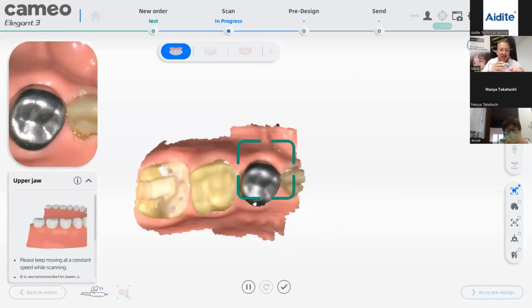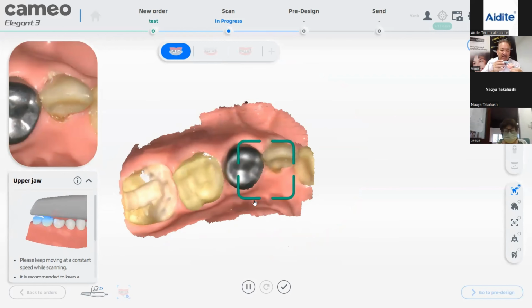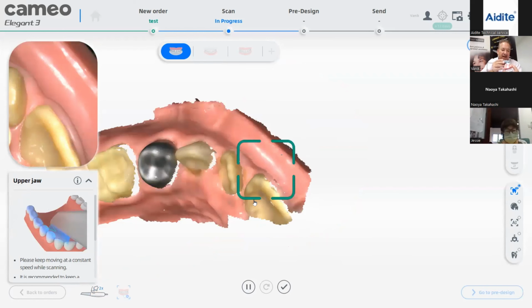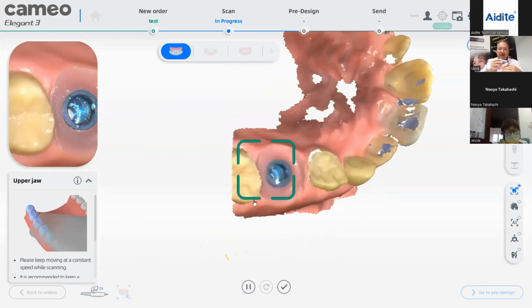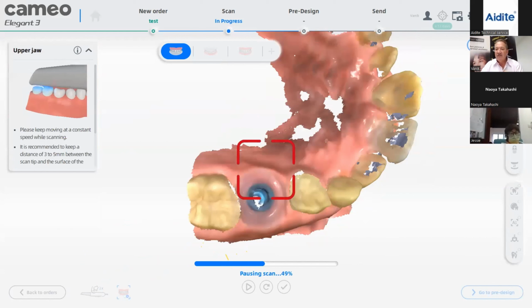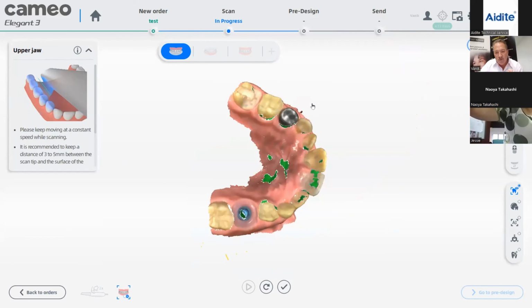I have one dentist who is complaining the scanner is too fast. He's staying on that area and scanning and scanning and scanning, turning slowly like this, going very slowly. He's very careful, like you see here, but he's already got 264 pictures. This is too many pictures to start. In the beginning, your goal is to go really fast. That's the first thing you want to do.